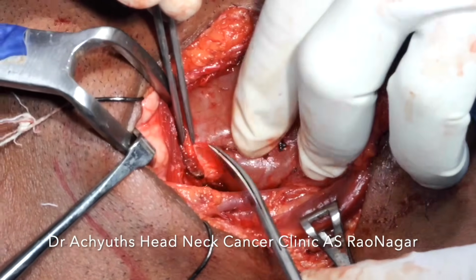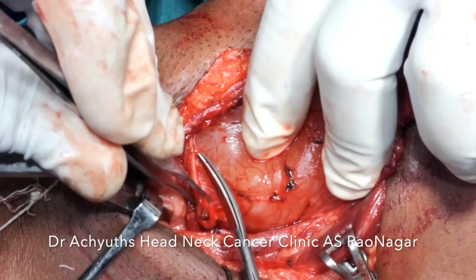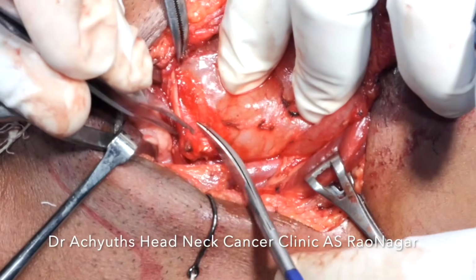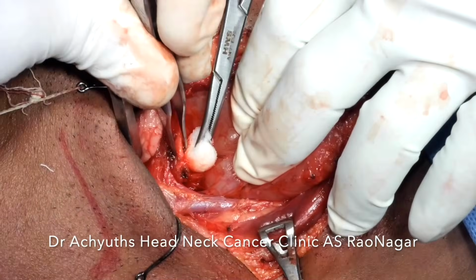Once the lateral border is becoming free, we can hold it with an Alice forceps or with the ring of any forceps like mosquito forceps or medium size artery or whatever, but here we held it with the help of an Alice forceps.